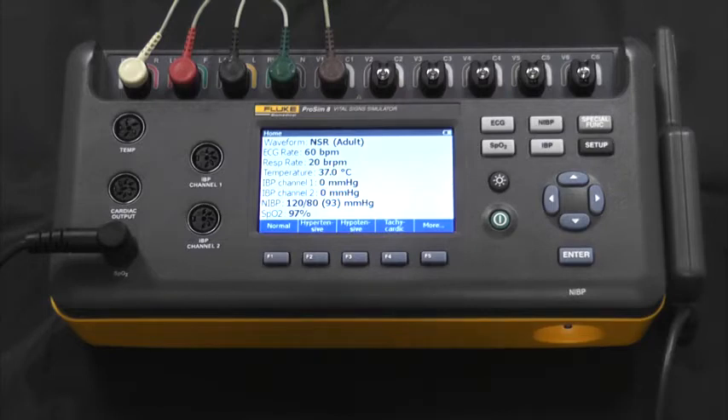In the rear of the device, there is a USB port for remote access, as well as a high-level ECG output.